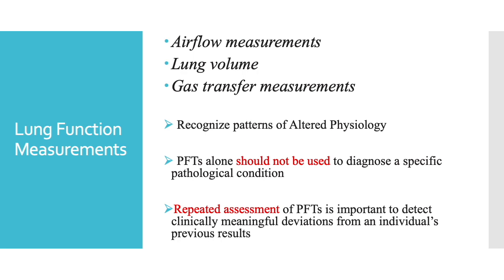When we do lung function assessment, we perform airflow measurements, lung volume and gas transfer measurements. The main area of this video would be around the airflow measurements, or the spirometry. I would be giving the screenshot of the charts for the flow volume and the gas transfer as well, but that would be out of the scope of this video and we can have more videos on that later.